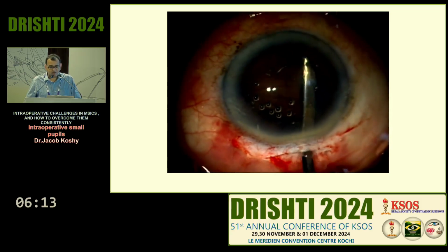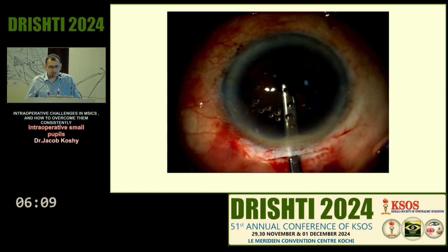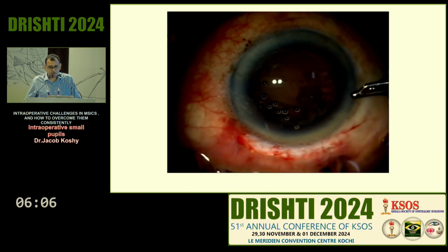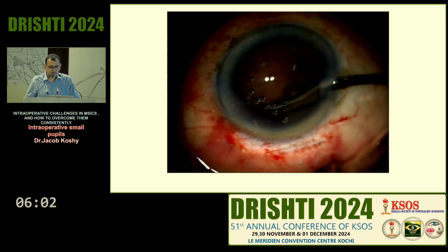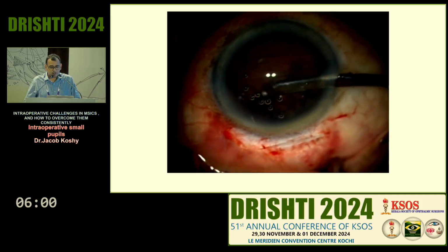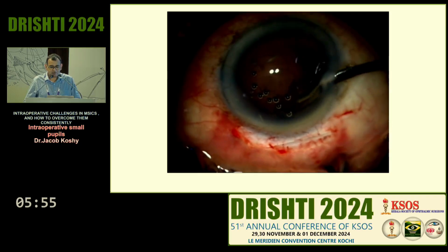Once you've done a good vitrectomy, a dry aspiration, you keep putting viscoelastic and do a dry aspiration. Unless you're very sure, don't have fluid flowing into the eye. It will just go and hydrate the vitreous, and more vitreous will pop out. But you can do a dry aspiration, keep it in retroillumination, and try and see what's going on.